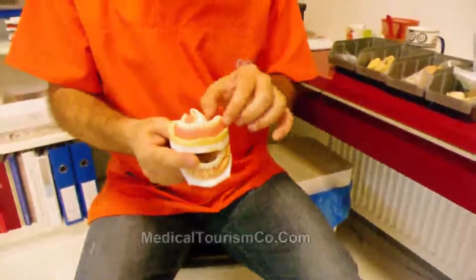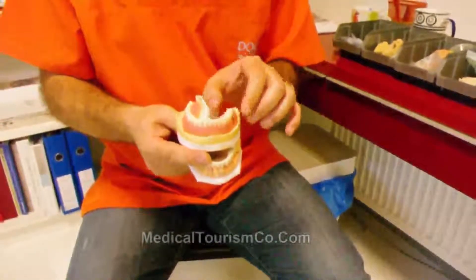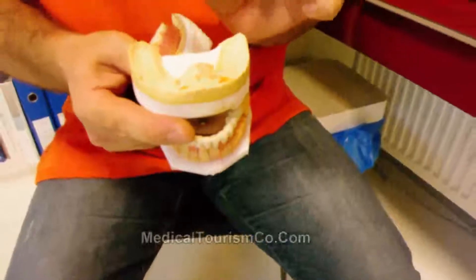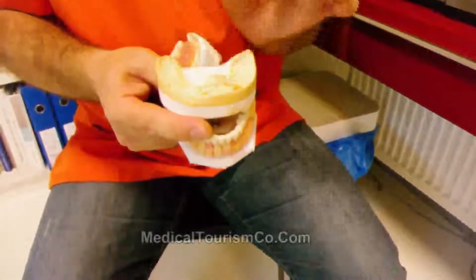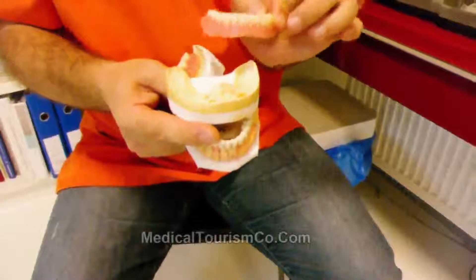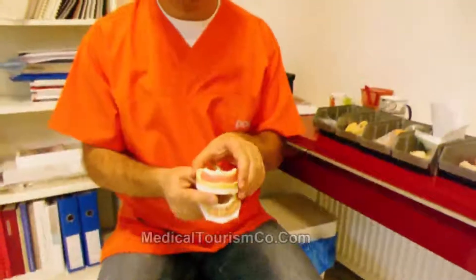This overdenture works as a fixed prosthesis. It cannot move while chewing because there are two abutment implants which keep the prosthesis in place. This is a detachable system — the patient can detach the prosthesis, clean the implants, the mouth, and the prosthesis, and then put it back in place.